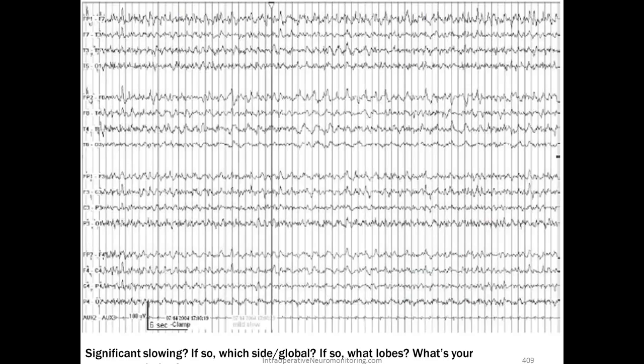All right, so this is an example. A lot of traces there, and it doesn't look like anything's jumping off the screen, really. So if we do our pecking order, we look at our traces, we find where's our left versus our right, where's our frontal, where's our temporal. We see the odd numbers here, the even here, odd here, even there. So it's kind of skipping. It goes left, right, but it's going from anterior to posterior on this recording. We see that we have a line drawn here. So that's kind of something tipping us off.